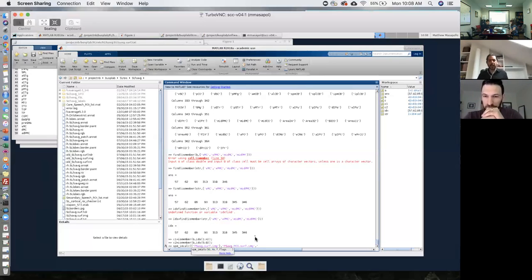Okay, and now you have to enter here the third argument to SPM imcalc, which is basically the formula that you want to apply. Typically, you can do anything with SPM imcalc in terms of operations. Typically, you can enter two input files, one output file, and then say I want to add them. When you enter multiple files, they always get the names I1 for the first file's data, I2 the second, I3 the third, and so on. So if you enter two files and you just want to add them, you would enter something like I1 plus I2, and that would be all of it. You have to give here as a third argument the formula. These are the input files, this is the output file, and then the formula that you want to use.